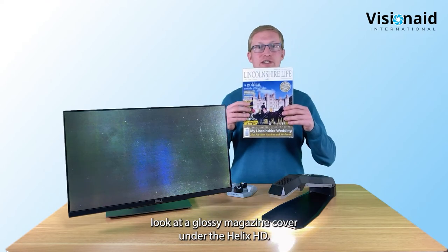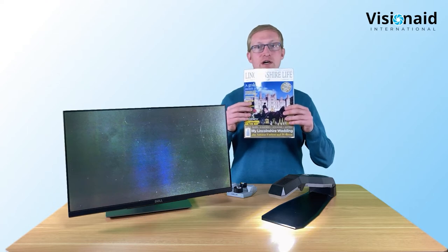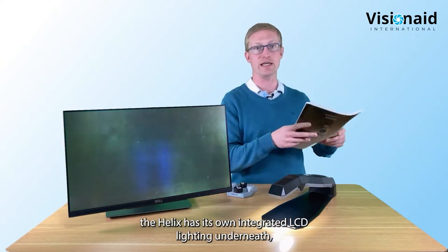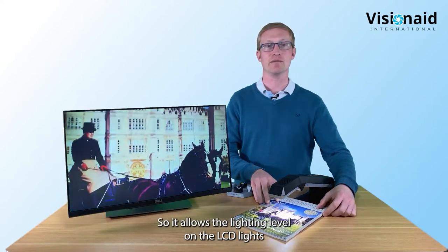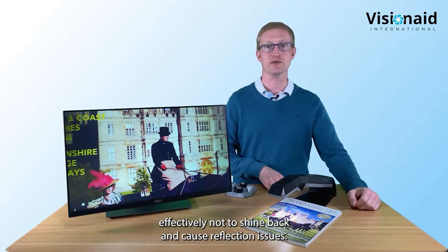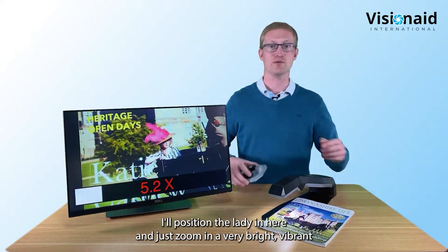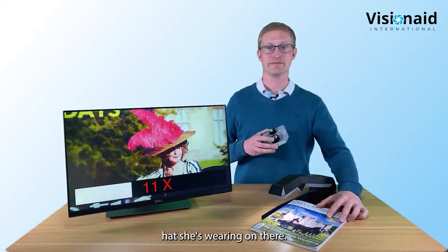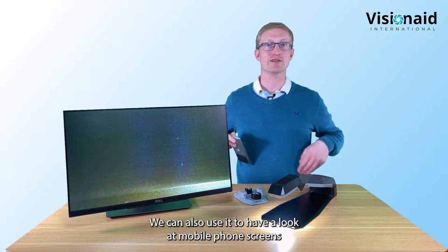Now we'll look at a glossy magazine cover under the Helix HD. Glossy documents can sometimes cause reflection problems with desktop video magnifiers. However, the Helix has its own integrated LED lighting underneath which adjusts automatically and is polarized - it prevents the LEDs from shining back and causing reflections when looking at glossy surfaces. So there are no reflections or issues on the image.